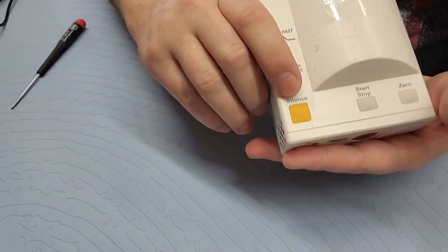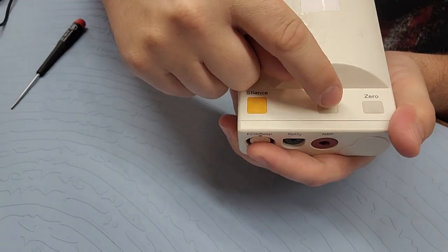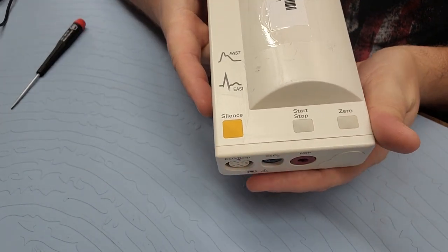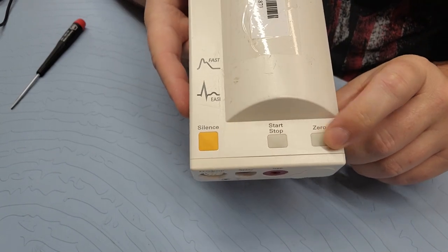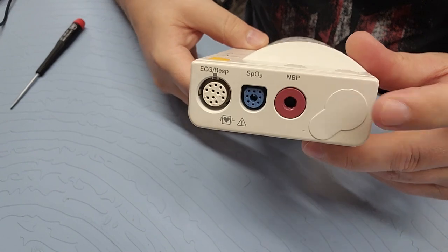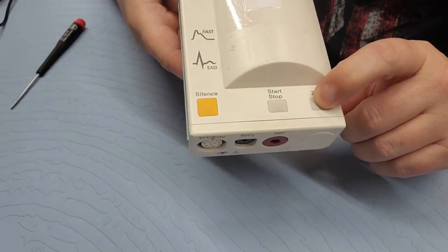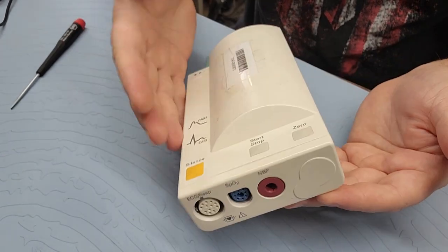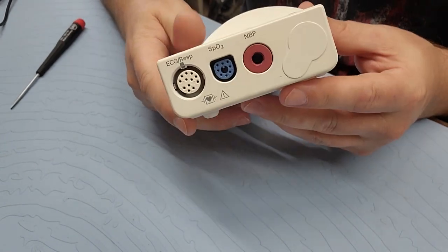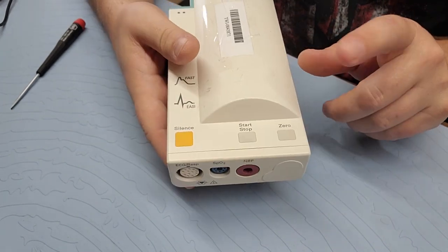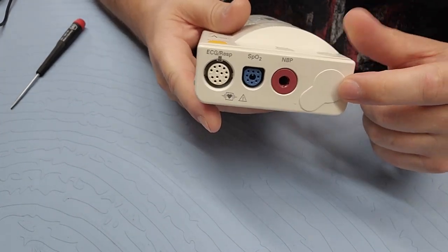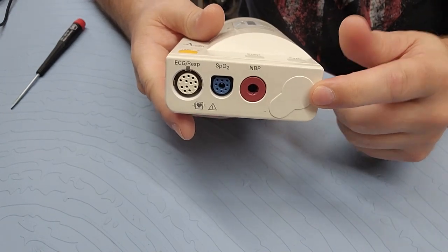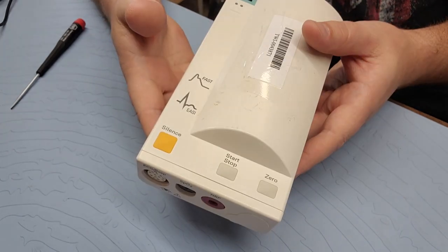You can see there's a few buttons on the outside that you can activate. There's a silence button, there's a start and stop that's for the NIBP, and you have a zero button, which the zero button is normally to zero your transducer for arterial. You have to zero it out before you can apply pressure so you have a baseline.